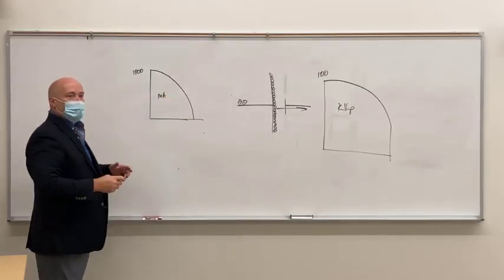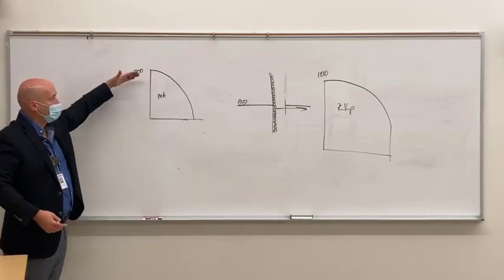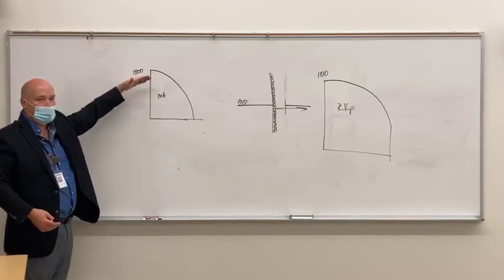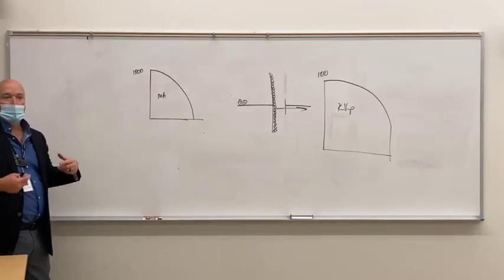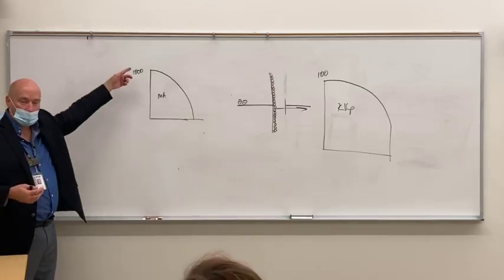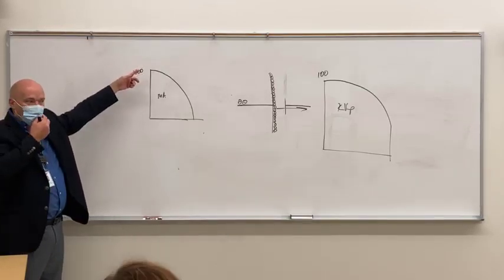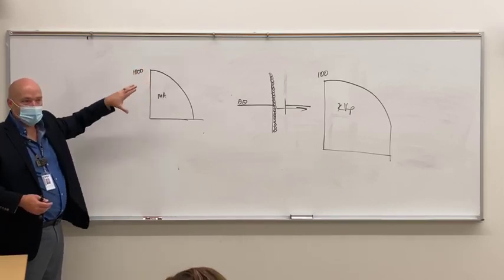The purpose for this is to limit motion, to give you the shortest exposure time possible. So if you shoot with 1000 mA and you shoot a chest X-ray, your exposure time is going to be really, really quick. So if you're doing cardiac catheterization where the heart's moving at all times, you want short exposure, right? So that's the purpose for these type of machines.